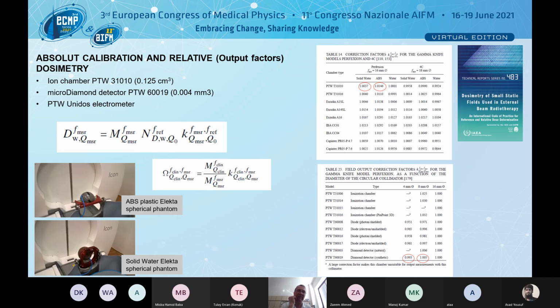So maybe this lecture at least will lead you to think about it, maybe read it. Everything is inside this document. Also, some people did complain that it's maybe not well organized, but I think you can really find everything in there.